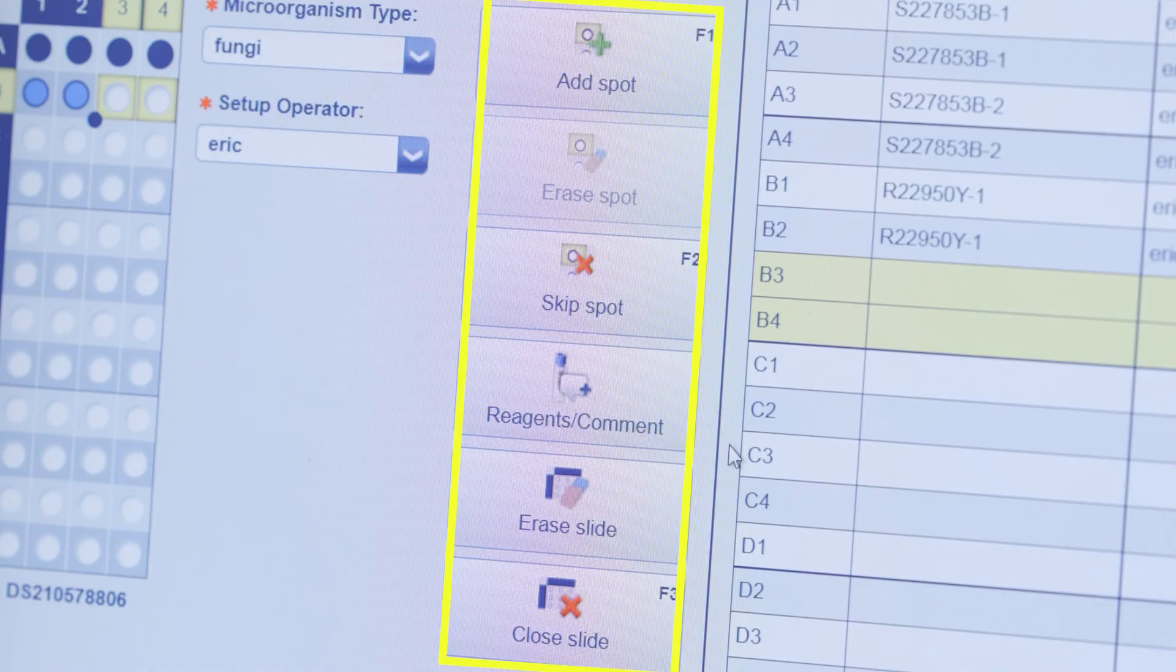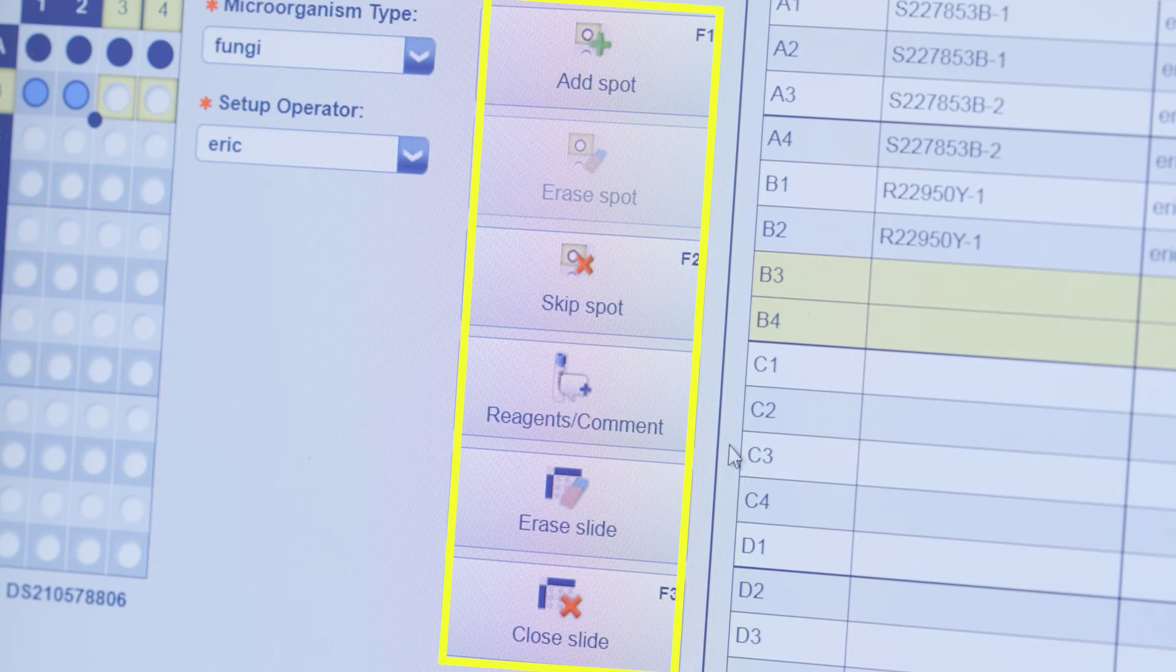Additional action buttons can be used to add, erase, add comments to spots, or erase the slide if needed.